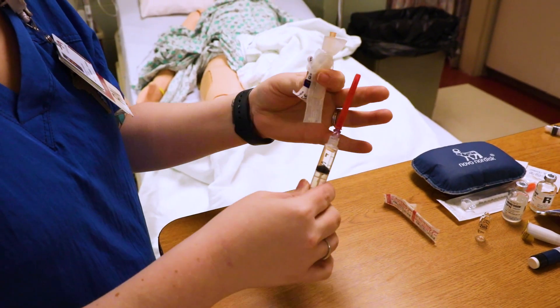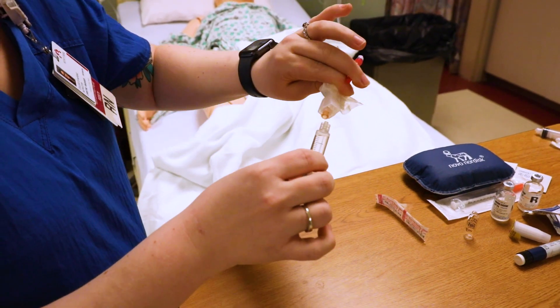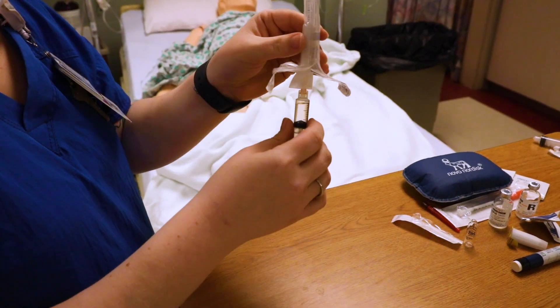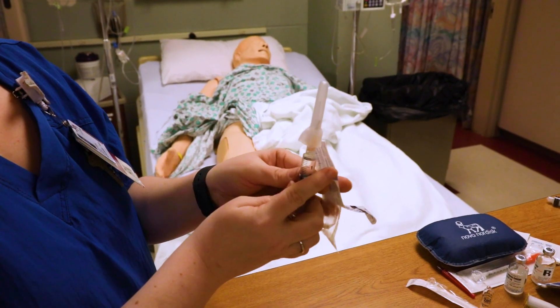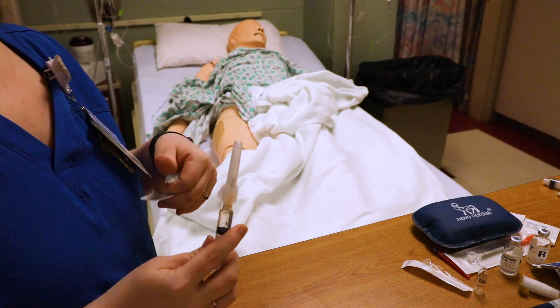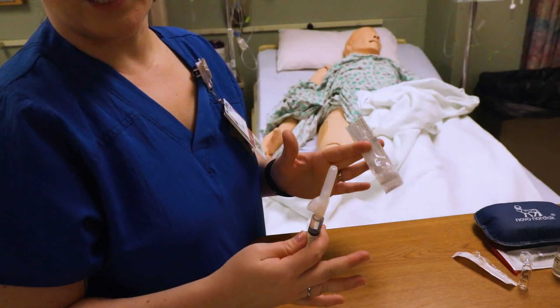Unscrew the blunt needle, take the two pieces and put them together. The blunt needle goes in the sharps. Then you're ready to inject your patient — make sure you get rid of all the air, and then make sure you do your five or six rights of medication and do all of your checks.